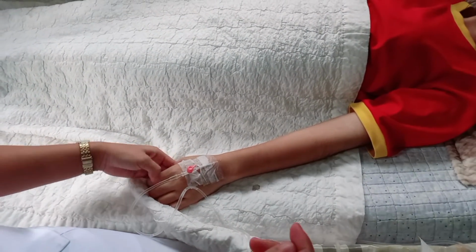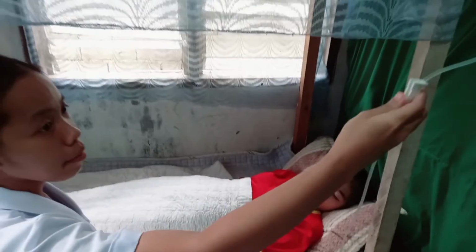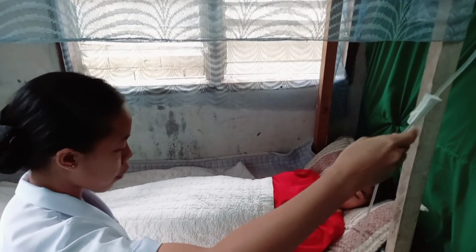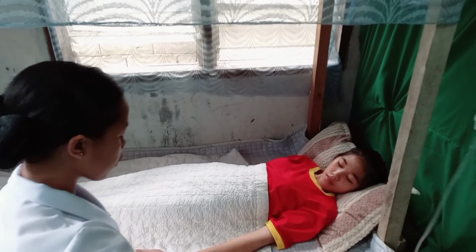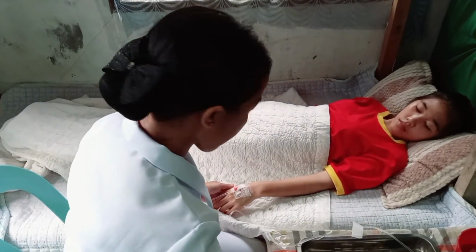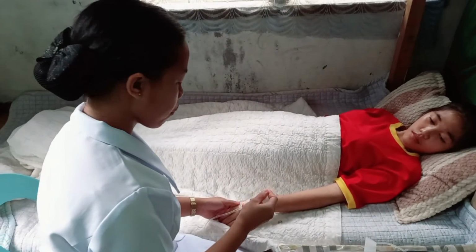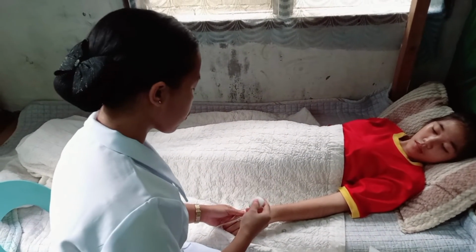So before removing the needle, we need to clamp the infusion tubings to prevent the fluid from flowing out of the needle onto the patient or on the bed. And then we will place a cotton ball before removing the needle.